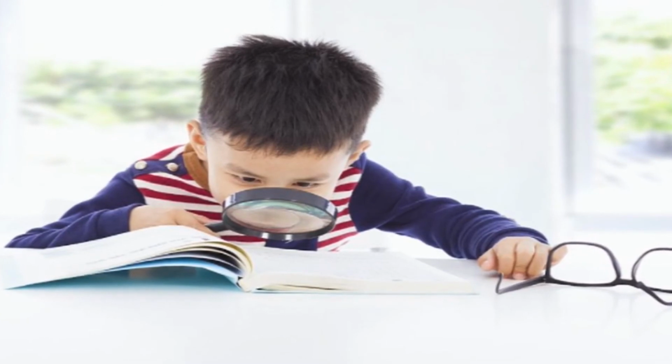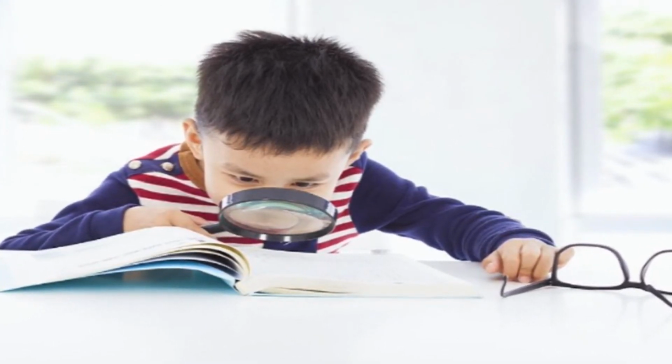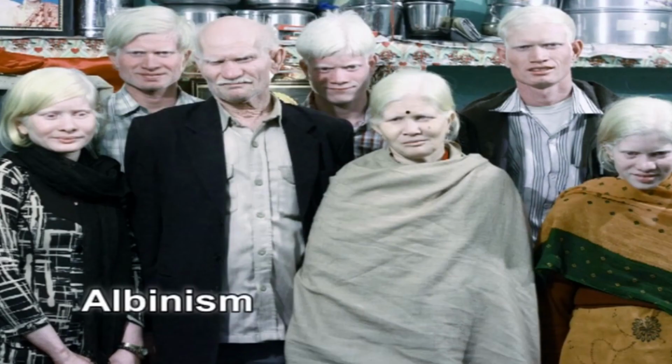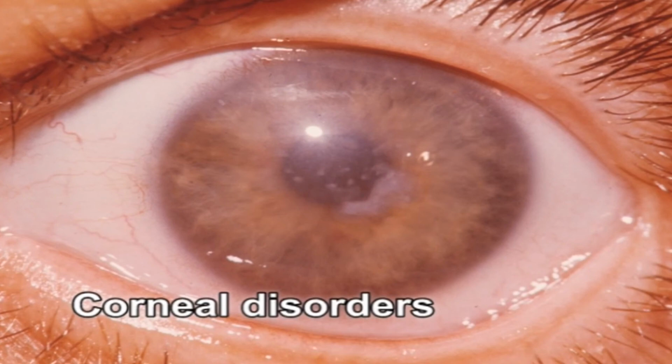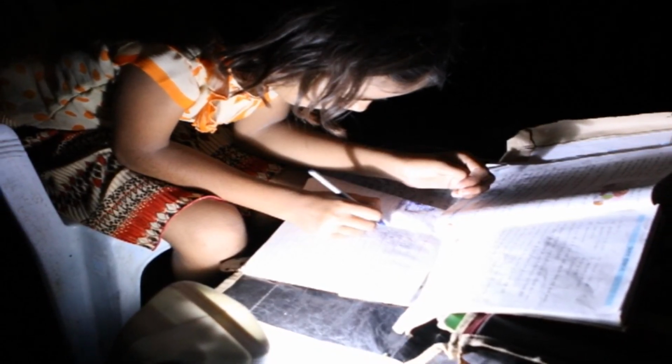Not all children need extra lighting. As a result of some eye conditions like aniridia, cone dystrophy, albinism, or corneal disorders, a child may require dim lighting in order to visually feel more comfortable. Using low vision devices will not improve the child's vision in future. With the help of low vision devices, the child can do better and visually feel more comfortable.